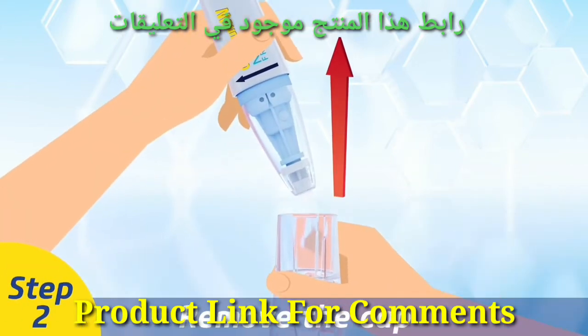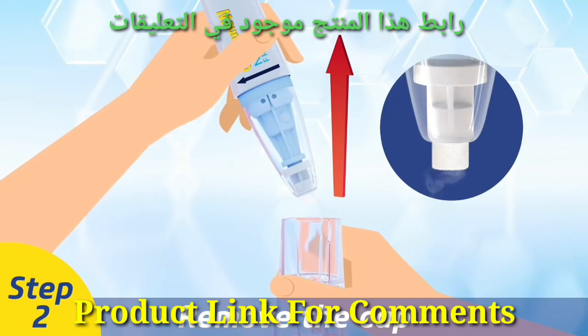Step 2. Remove the cap. The applicator tip should have a frosty appearance. If not, repeat Step 1.